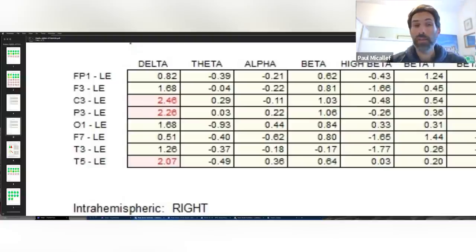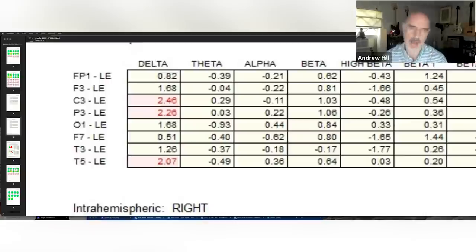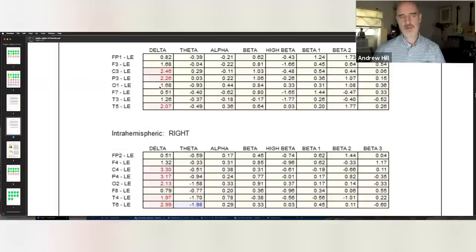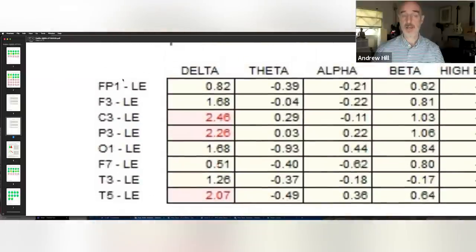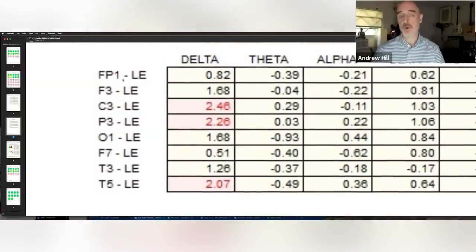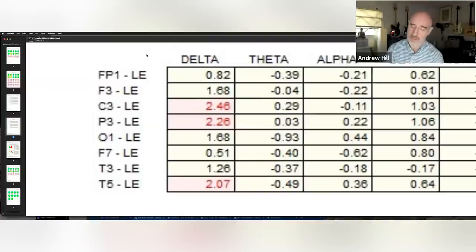I've been diagnosed with excessive daytime sleepiness. Oh yeah, sure, there we go. Whenever I see delta pushed up this high, people feel really tired. They feel like they're not getting enough deep sleep. When this hangs out above one or at one or above one for a while, for a few months, it eventually collapses into negative numbers. You're not there - this is actually the less acute version. This is like sleep deprivation for some reason, maybe it's apnea. I'm seeing a brain that is like 'Why do I feel tired?'